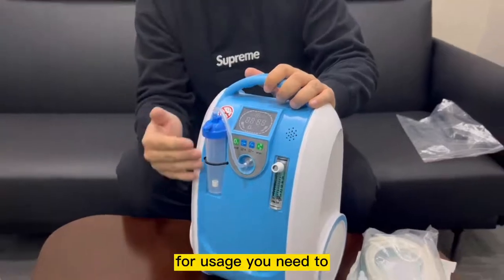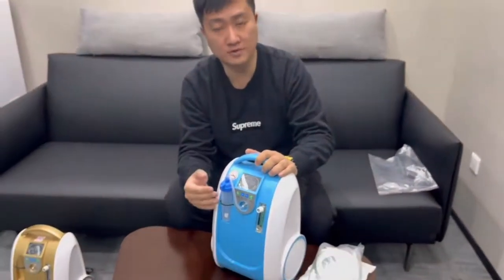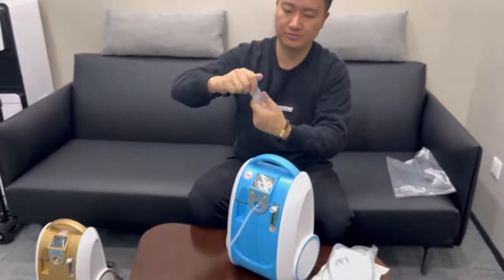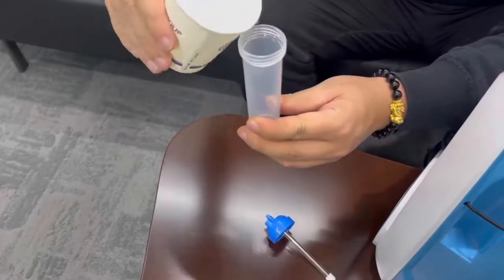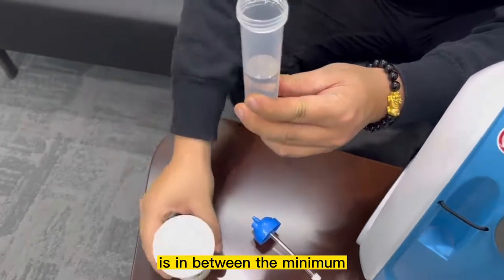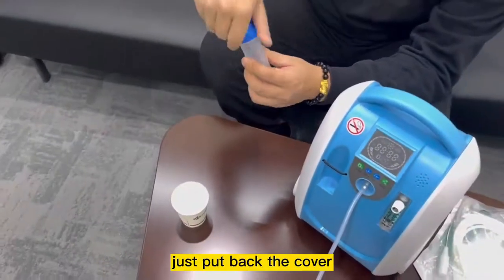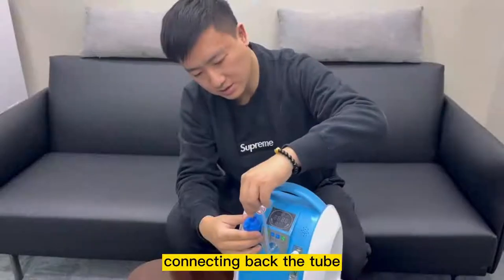And of course, for usage, you need to fill up the water in between the minimum and the maximum point. So we'll actually do a demonstration as well — fill up the humidifier bottle with water. Make sure that the water level is in between the minimum and the maximum water level. Next, just put back the cover and connect back the tubes.